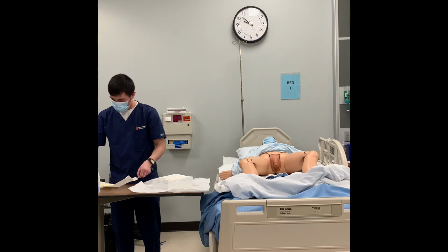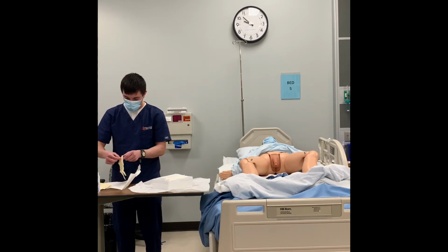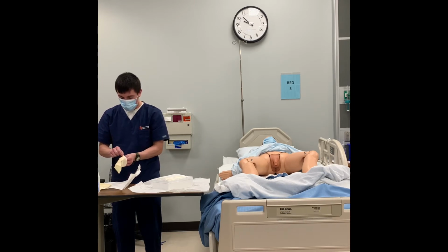Same thing, just grabbing that border and spreading out a little further. Okay, there we go. Now I will don my sterile gloves, making sure that I don't touch the outside, that I'm just touching the inside of my gloves.